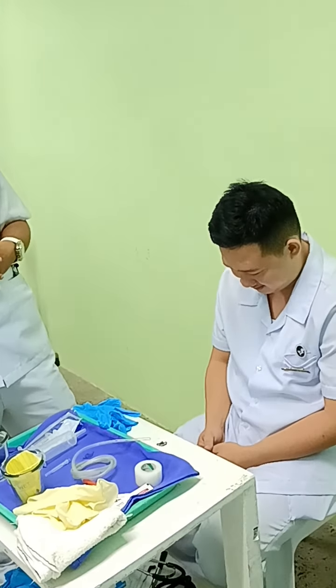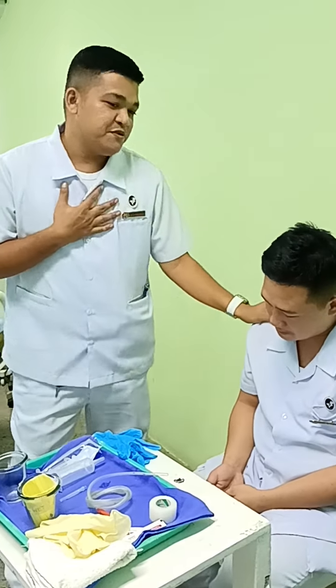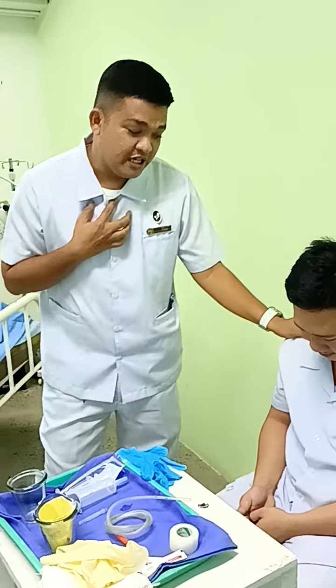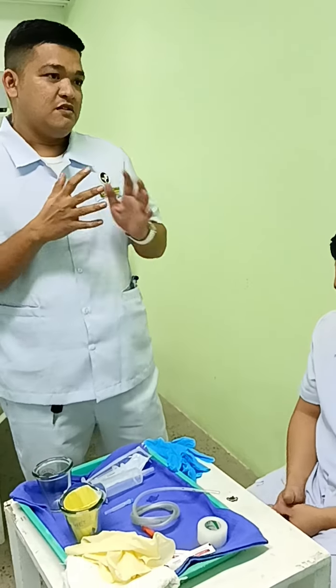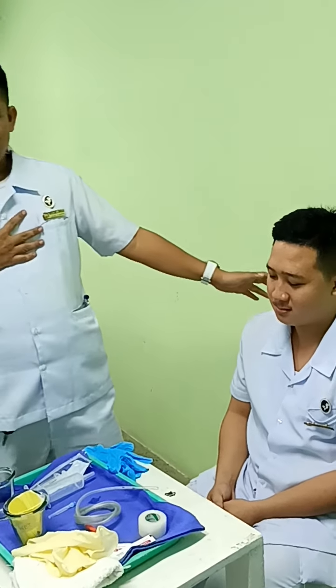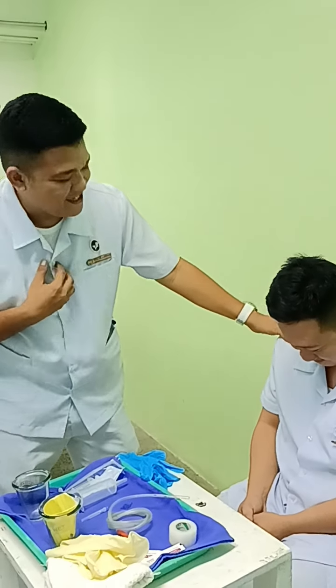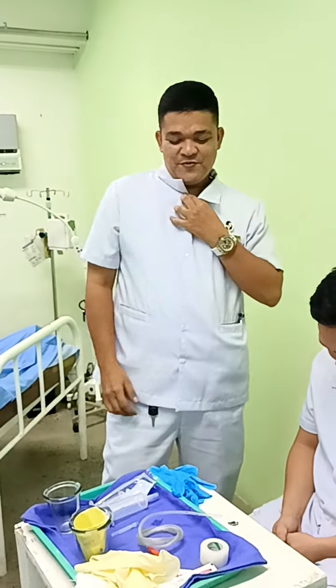Then next we're going to prepare all the materials needed and explain the procedure to the patient. Sir, I will be the one responsible for the NGT. Then we position the patient in a very comfortable position. If the patient is comatose, we will just put the patient in a semi-Fowler's position and provide a pillow at the back of his or her neck. After positioning the patient, we're going to cover using a towel.